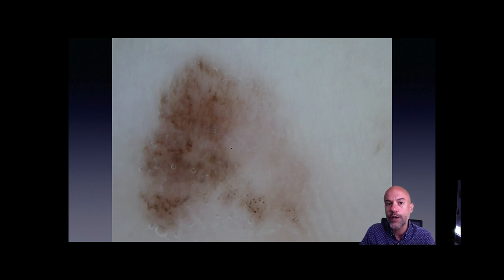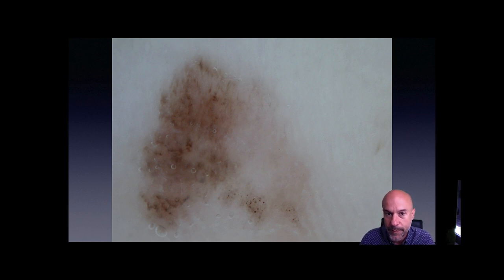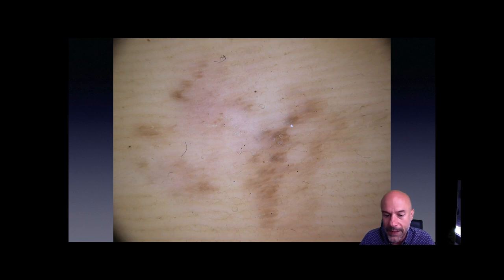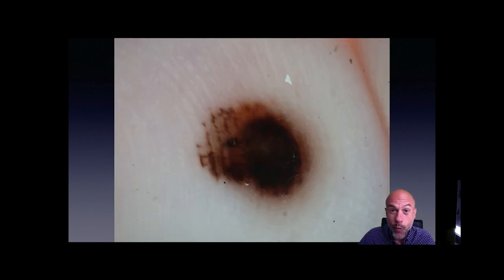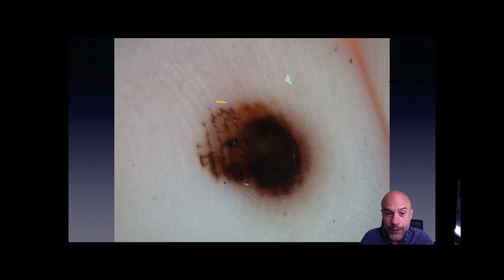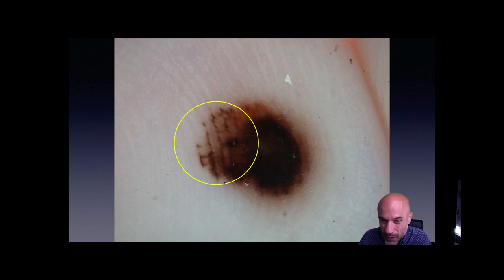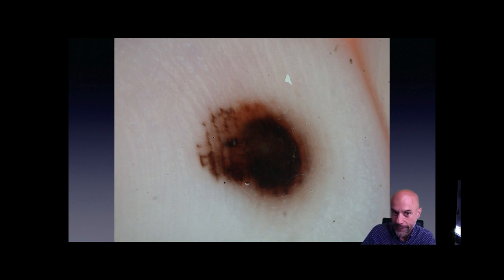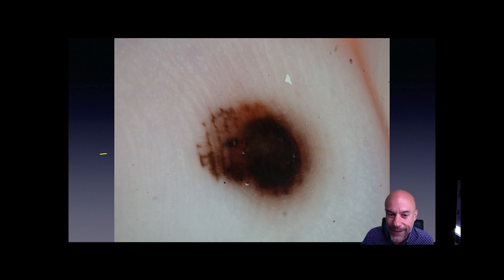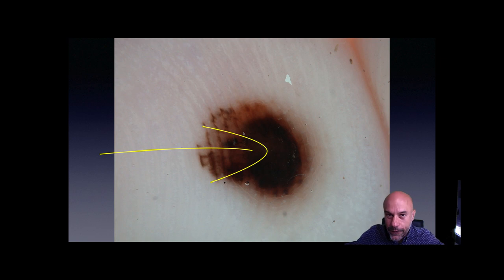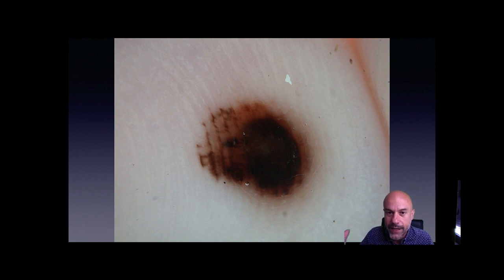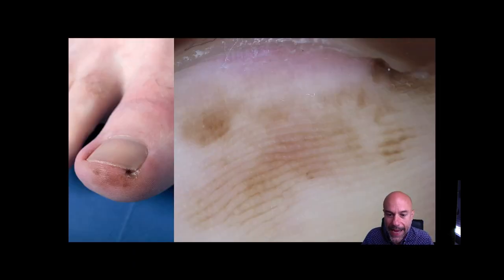One more example: neither furrows nor ridges, but who cares? This is a terribly chaotic lesion with irregular dots and globules — it's suspicious anyhow. One more example: I don't know if the pigmentation is on the furrows or the ridges, but I know this is a very asymmetric lesion. And the worst example: if you try to answer furrows or ridges, the answer is furrows on the left — so it could be very misleading. But if you try to answer symmetry or not symmetry, it's obviously very suspicious, because there are two completely different parts and an irregular blotch on the right side. Remember that the basic rules of morphology are also valid on acral moles.